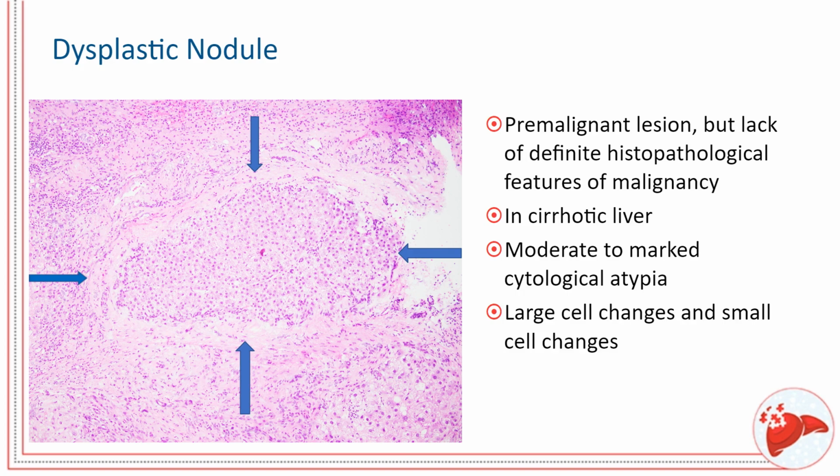Compared to the cirrhotic nodule here, the dysplastic nodule shows a higher N/C ratio, although the nucleoli look similar. So this higher N/C ratio makes this nodule stand out and look more crowded.